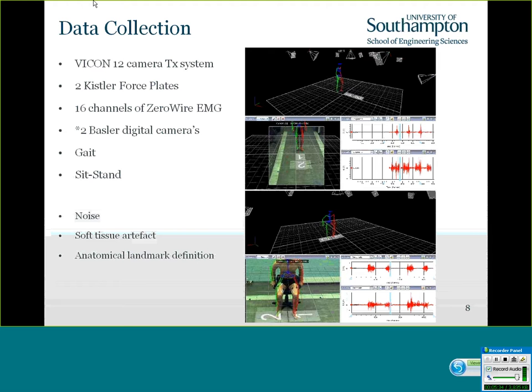With most marker sets, you place the markers over bony landmarks. However, even as a qualified physiotherapist, there is quite a large room for error during this process due to the fact that some of the landmarks are much larger than the markers that you're placing on them. So there is room for error there.